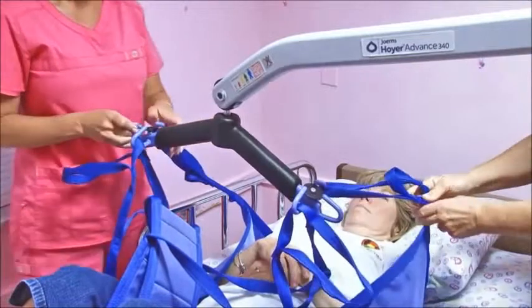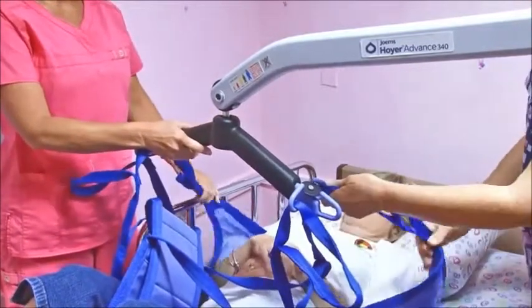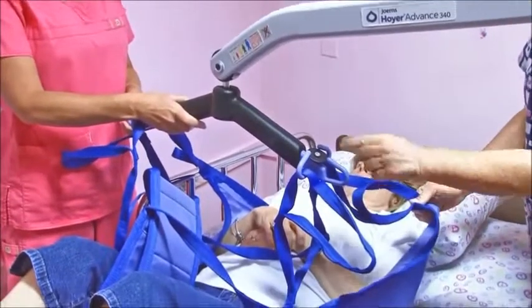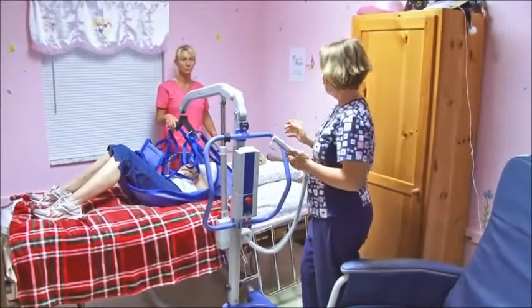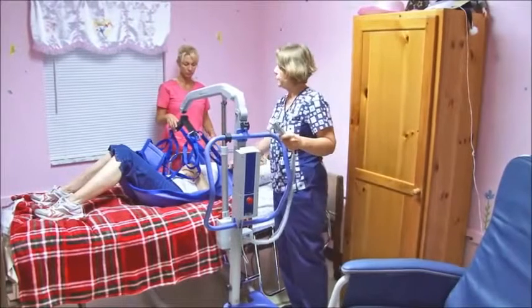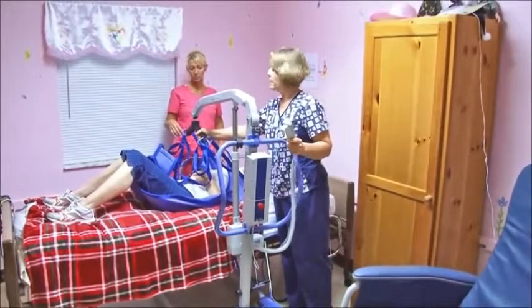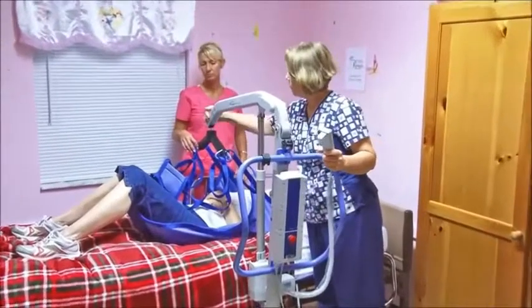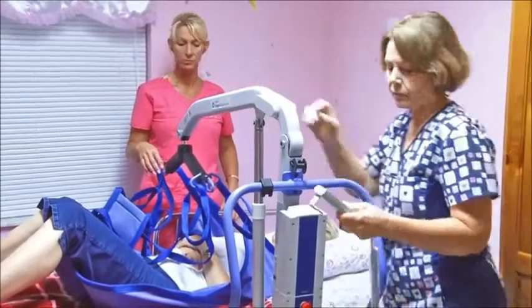You might want to look and see how much space there is now between the person and where you're going to be lifting them, and if you have to adjust it to a lower one, then just stop and adjust it to the lower one. Now we're going to raise the resident, and we're both going to be watching that she's supported. This bar, as she comes up off the bed, her head will be coming close to this bar. It is cushioned, but the upper portion is not, so we must be very careful about that.